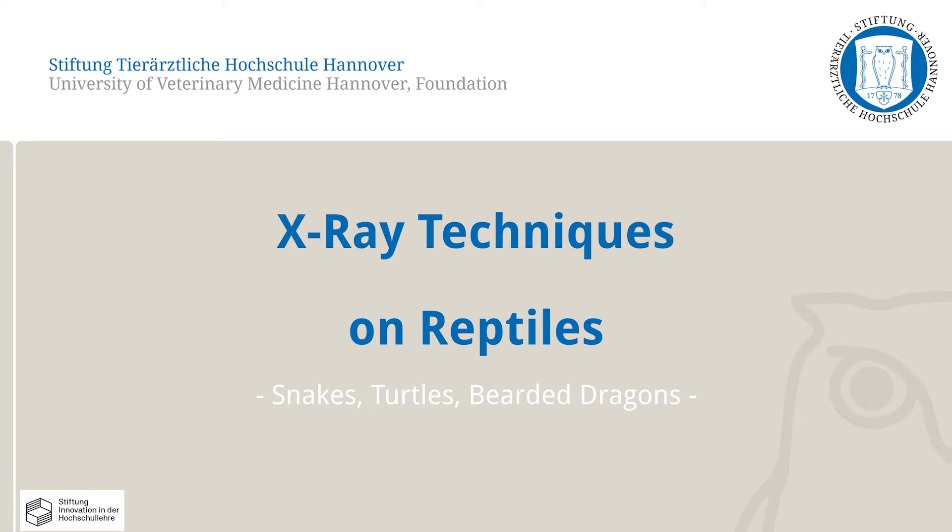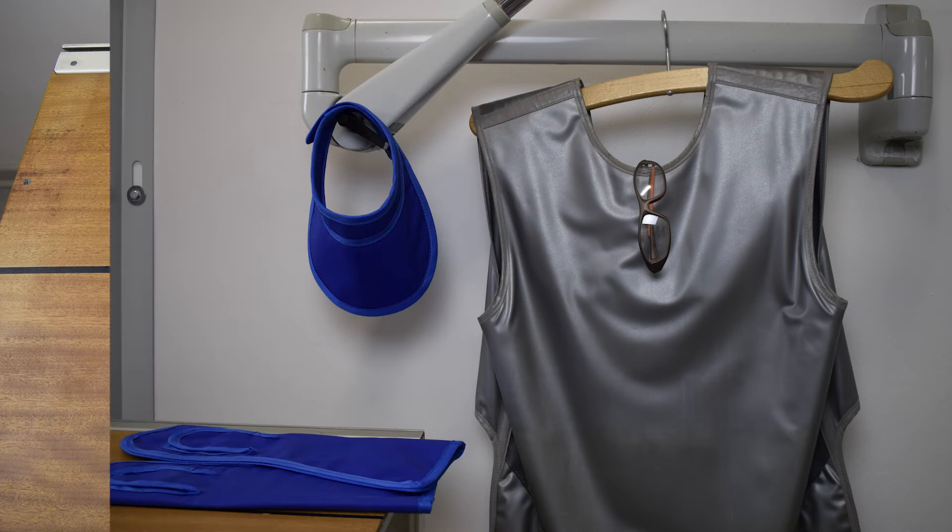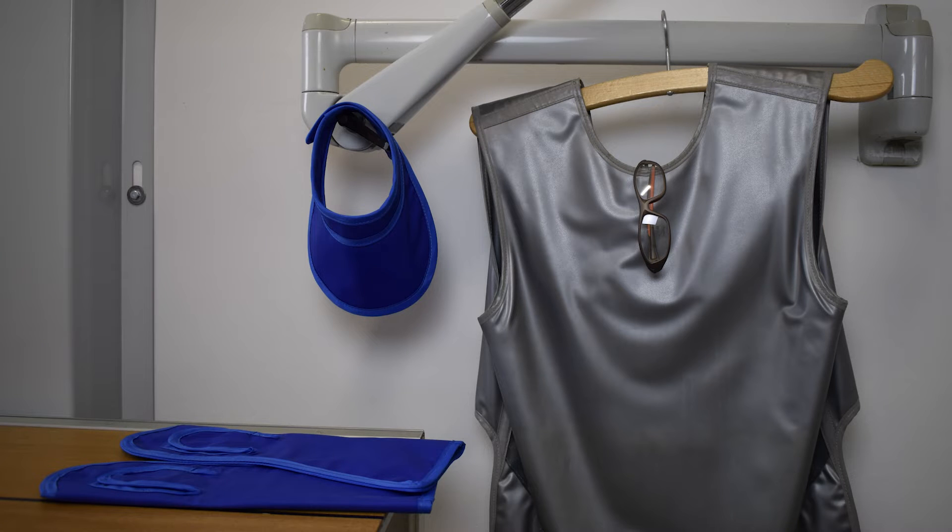Only one of the correct methods will be demonstrated. Needed for this skills lab exercise are a foam block protected with plastic, adhesive tape, x-ray plates, lead plates, and if necessary a tubular bandage, a side marker, scissors, and gloves. Radiation protection gloves, thyroid protection, and an x-ray apron and safety glasses are also required.